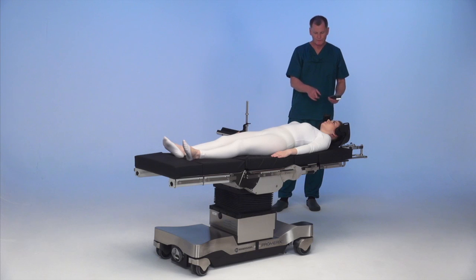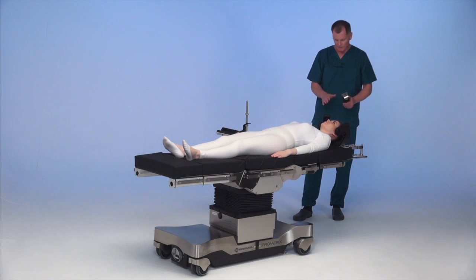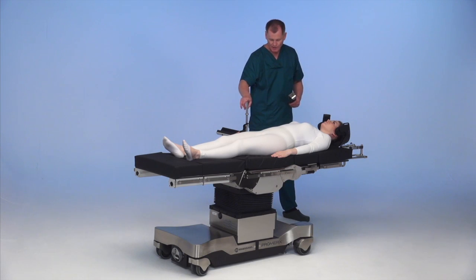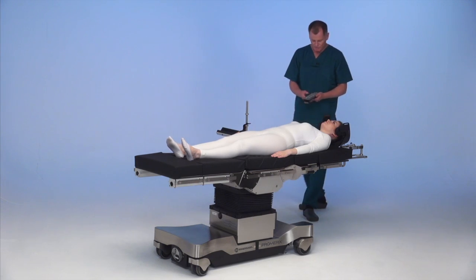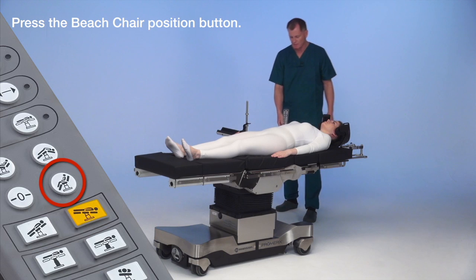We have removed the normal head piece and placed the Allen helmet on the table. We have the planing arm board, and we've also added the post for the body strap that will go across her once we get her in the beach chair position. She is currently intubated and ready to go for surgery, so we're going to hit the beach chair button on the table and start the process.